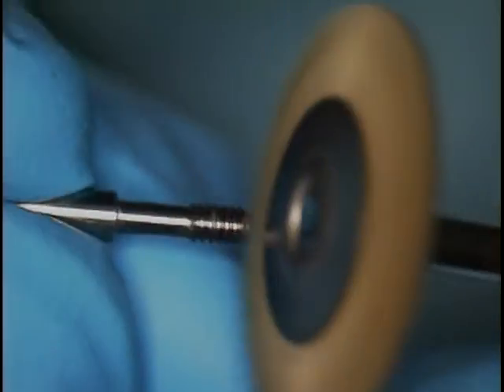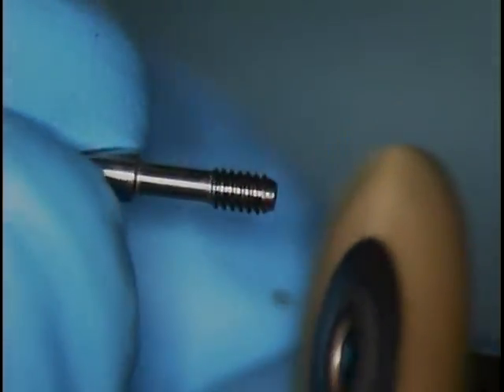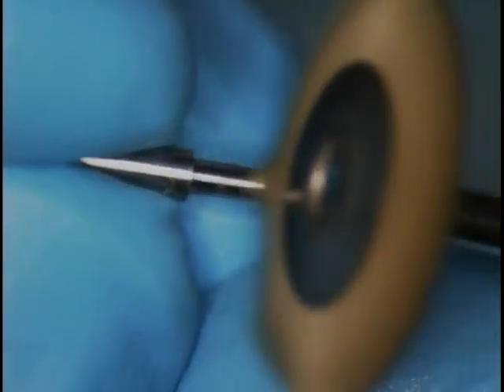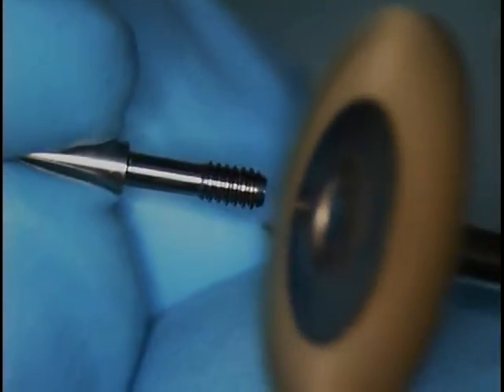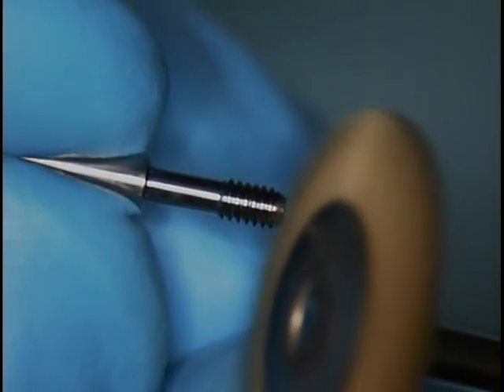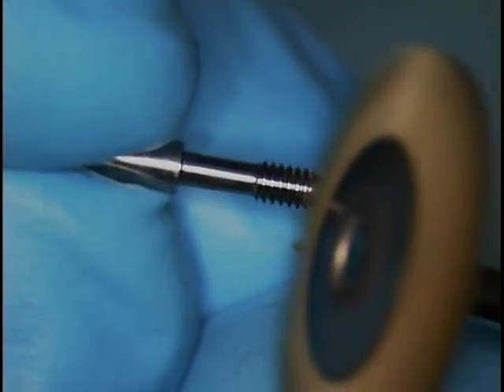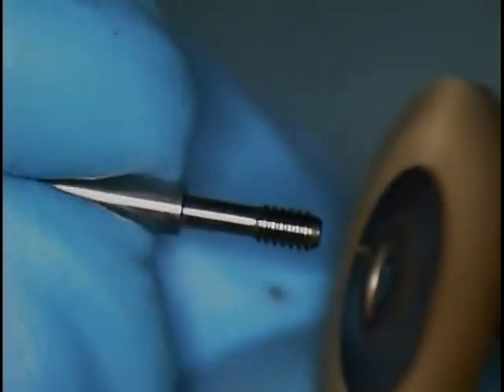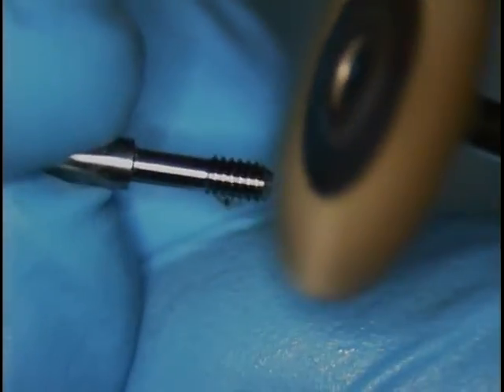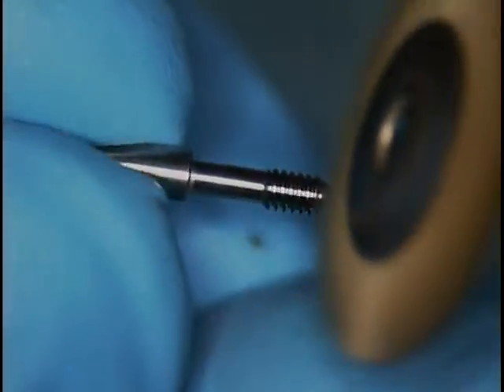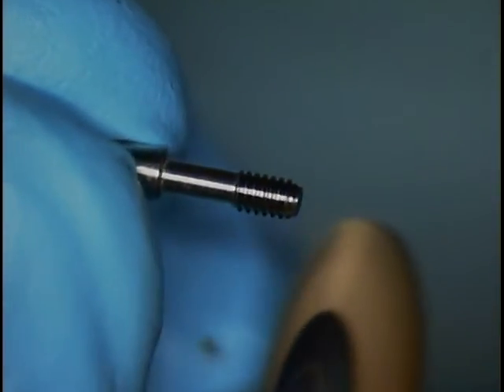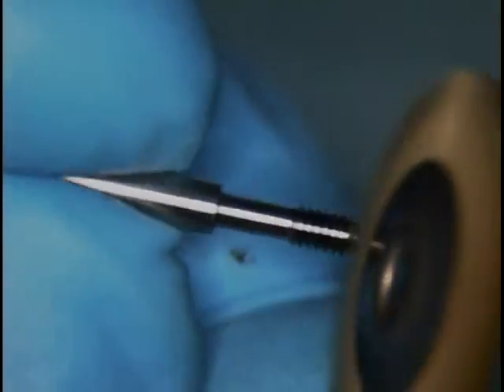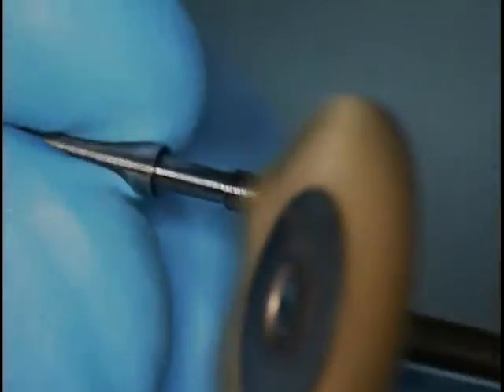We'll clean this off. Now we've got pristine threads, clean from any bio burden. Back in there, let's see if we bottom this out.